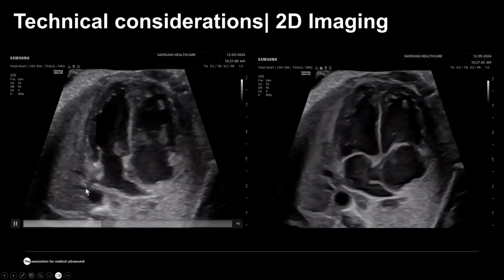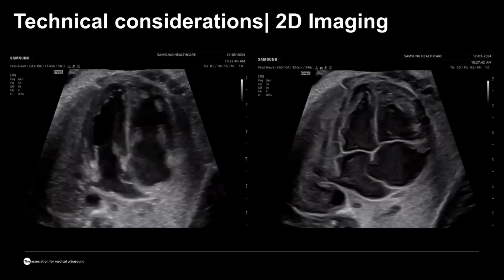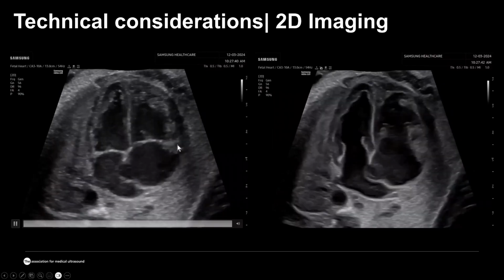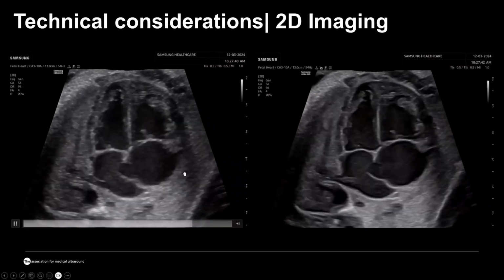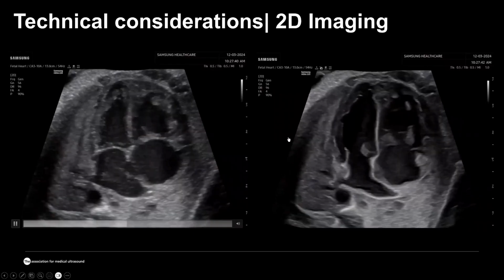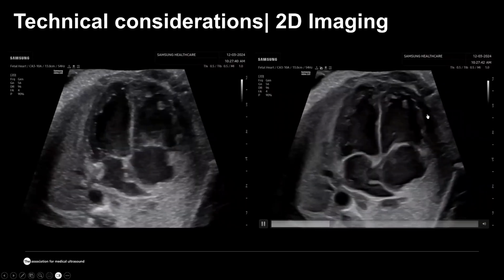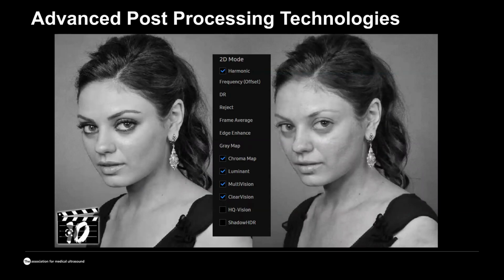So how can we jump from this image, which is our best image possible? You can see that historically the pediatric cardiologists like the image being a little bit grainy, shows pretty well all the structures we are looking at. But how can we jump to this one that shows even better resolution of all those details? Here we have a lot of advanced technologies, and in particular the post-processing technologies that allow us to do what is really demonstrated on this picture.